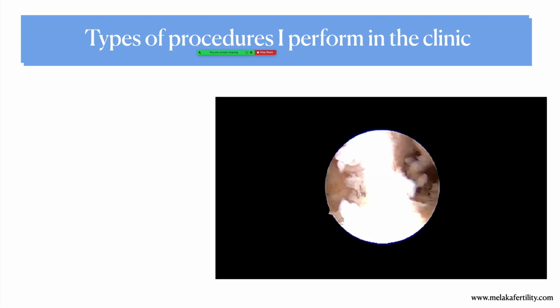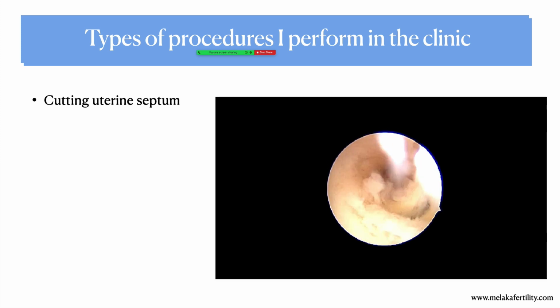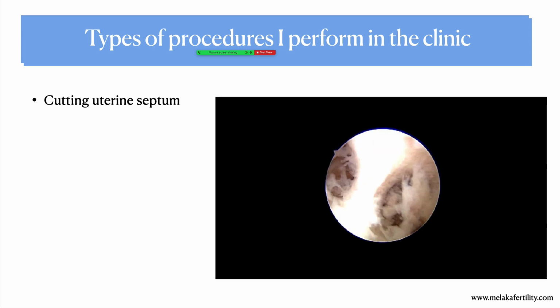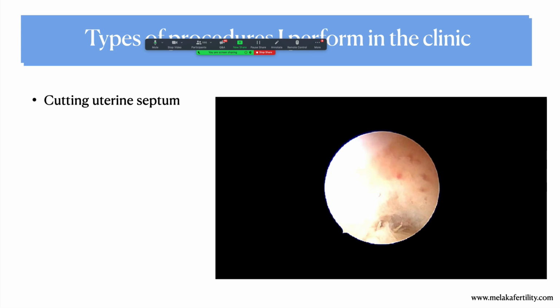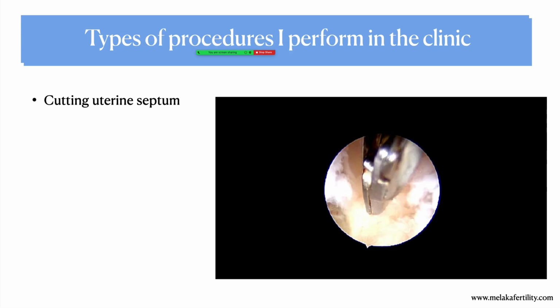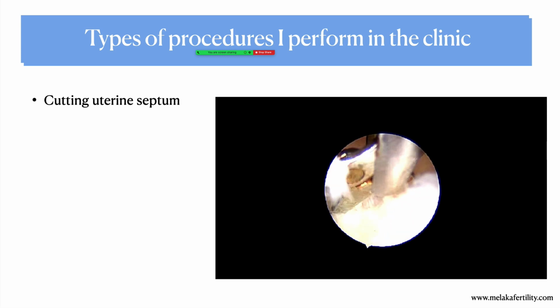Okay, I'll move on to the next case. Now, cutting a uterine septum, I don't like to do this in an office setup, but some patients are not very rich. They cannot afford to go to the operating theatre. So in such situations, I will do as much as possible of this incision of the uterine septum.